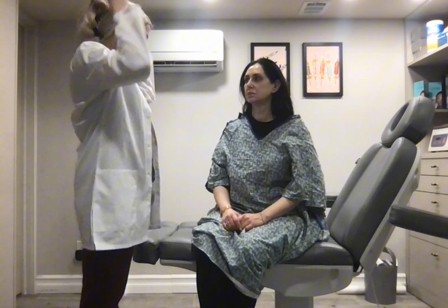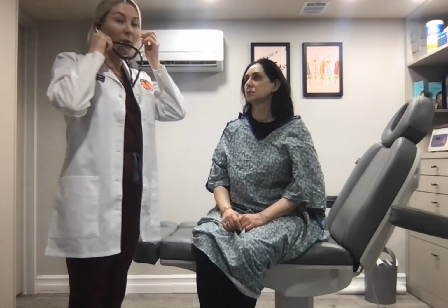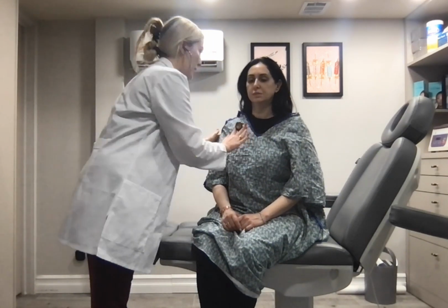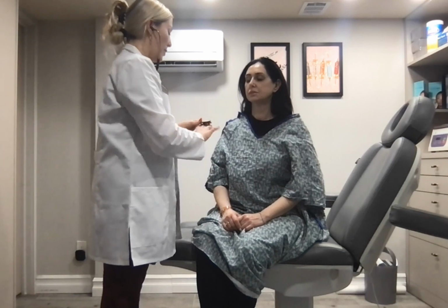Next, I'm going to be auscultating her lung sounds from the anterior thorax. Every time I place my bell on your chest, you're going to take a deep breath from me.